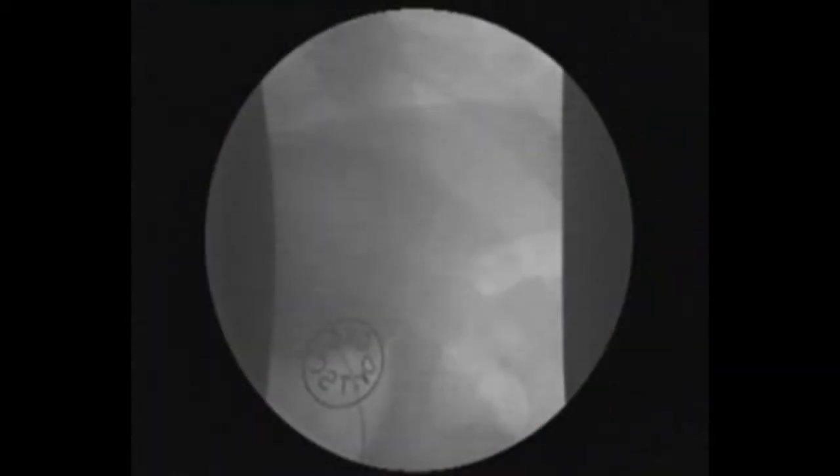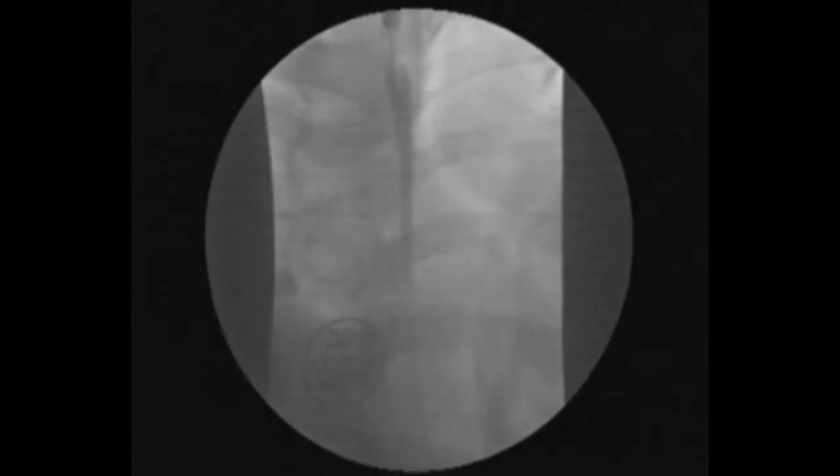Wire-guided pneumatic balloon dilatation can be done safely by placing a guide wire under fluoroscopic control across the gastroesophageal junction and checking the position of the guide wire.